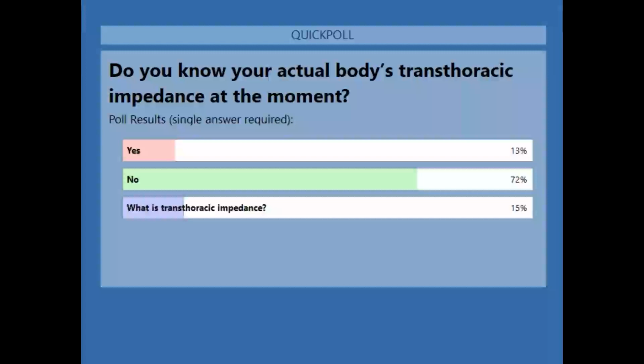Here at Fluke, we do have a multiple test load tool, a 7010 load box, that allows you to mimic patients from very small infants up to larger adults. So it's something to think about: what is your hospital typically, is it a hospital for children or an adult hospital? Because then maybe you can decide whether you should be using a multiple test load to do your testing. That's a good point, Elliot.